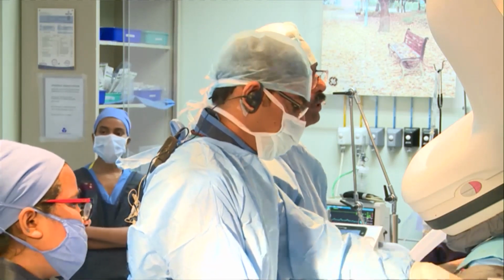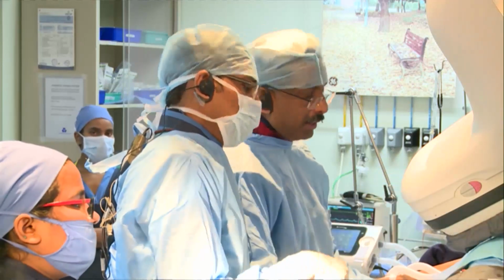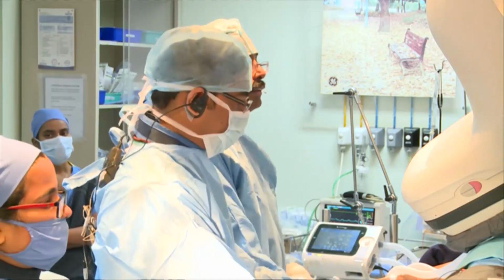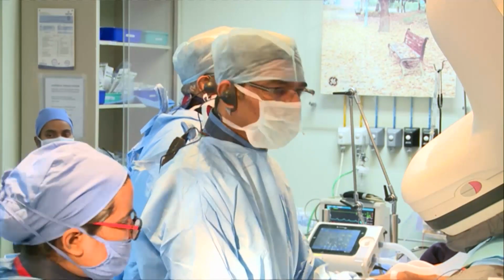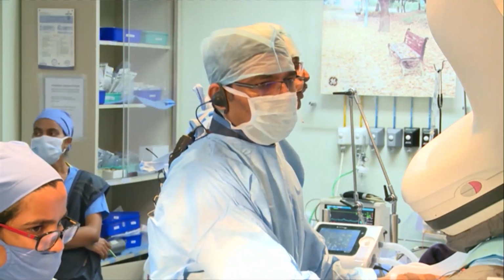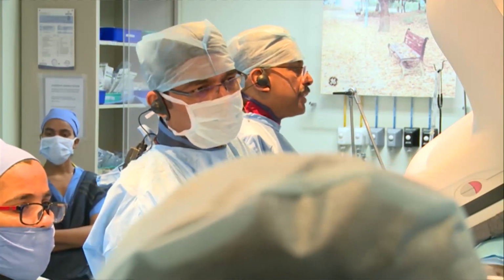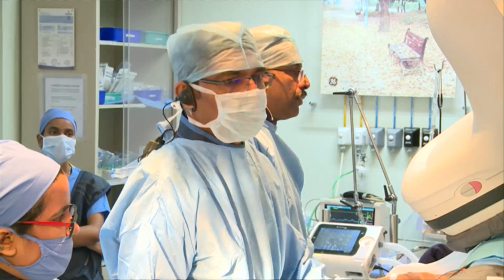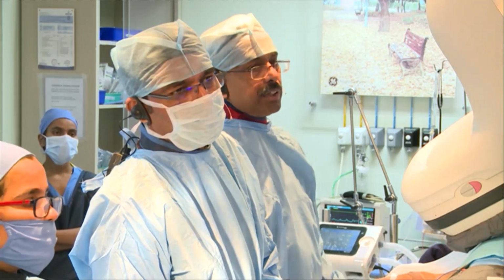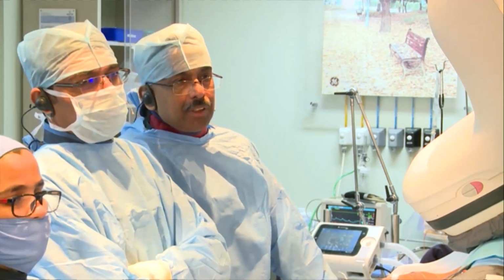And there are some people who even use the impeller first, and then once patients are a little stabilized, they go on to the IABP. There is a PROTECT trial with the impeller, which clearly showed that it's superior to the IABP. And today it's a class 1 indication. I think really the IABP is going to be restricted to mechanical complications, like VSR or septal rupture, patients going for surgery.